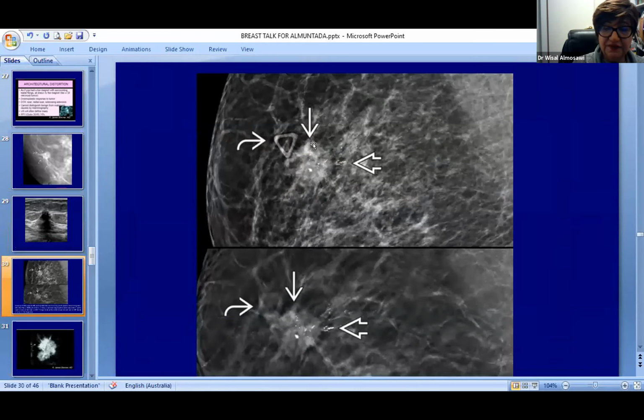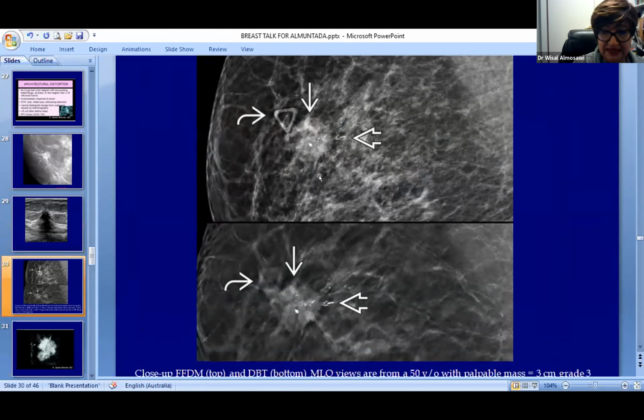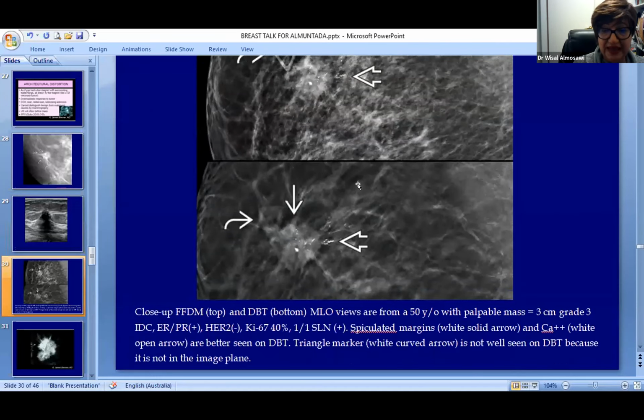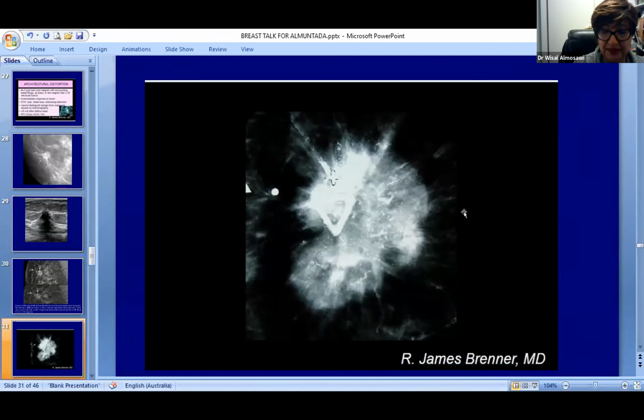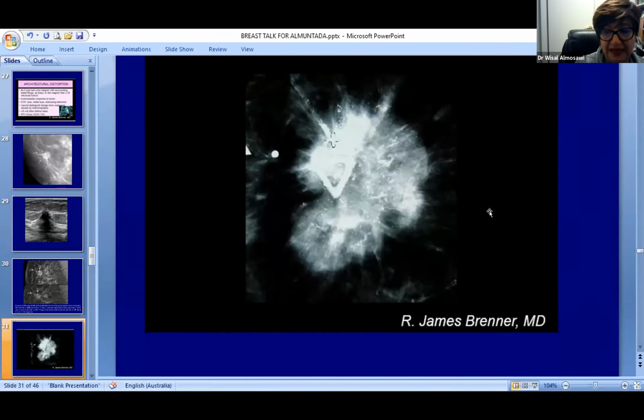When we see calcification in the mammogram and we want to biopsy it, we always put a marker because that makes it easier for the surgeon. When they want to go in and take the lesion out, they know where to go. And then when they take it out, we take an X-ray to make sure that they took the lesion which we marked for them. And we see the calcification, and we see the margin to make sure they got it with a clear margin, or if they need to go back in again.